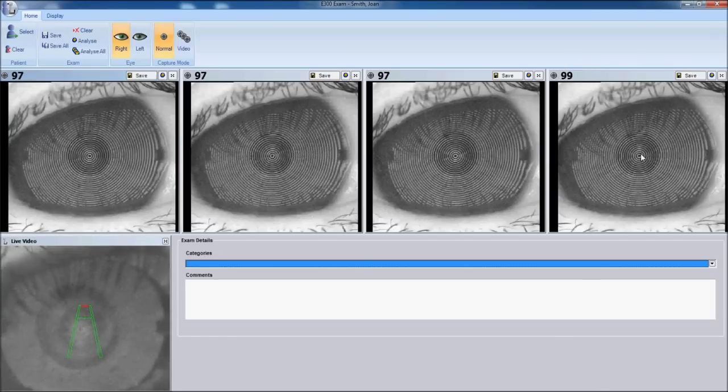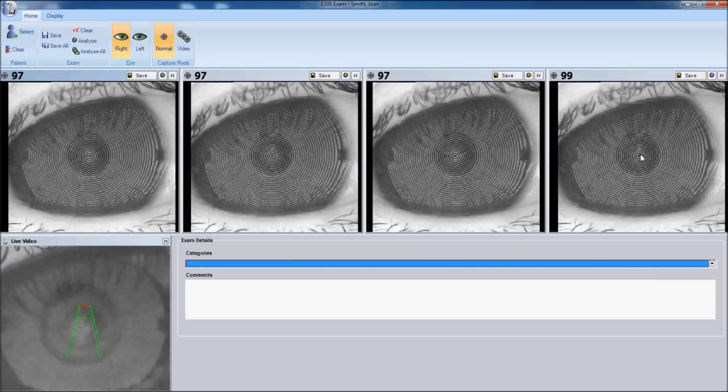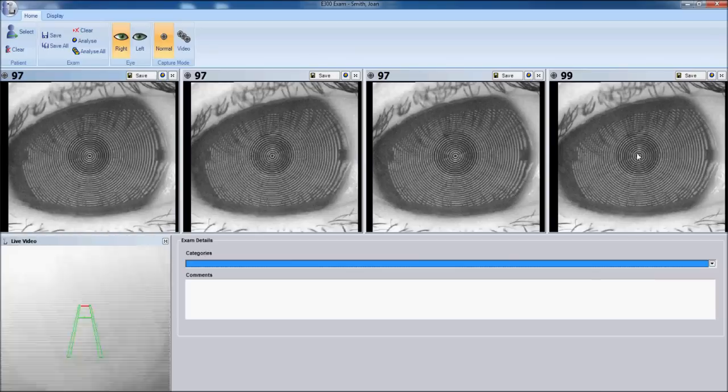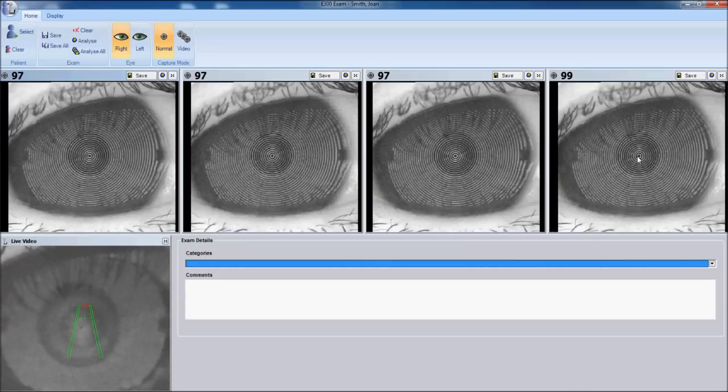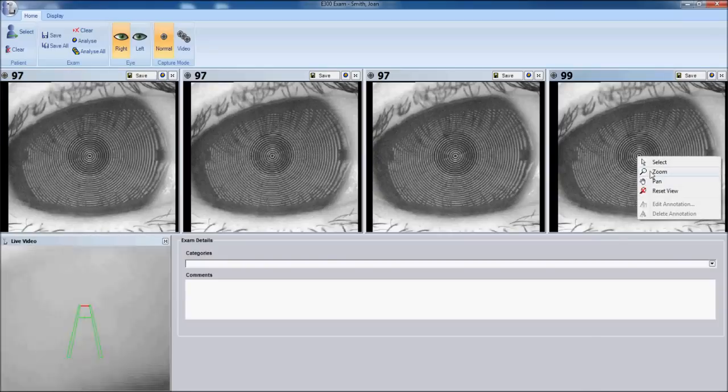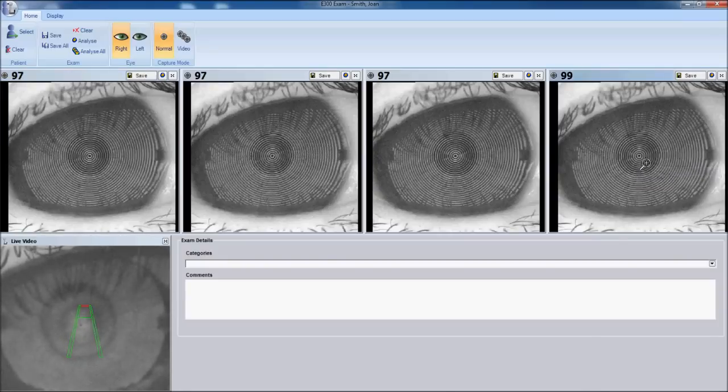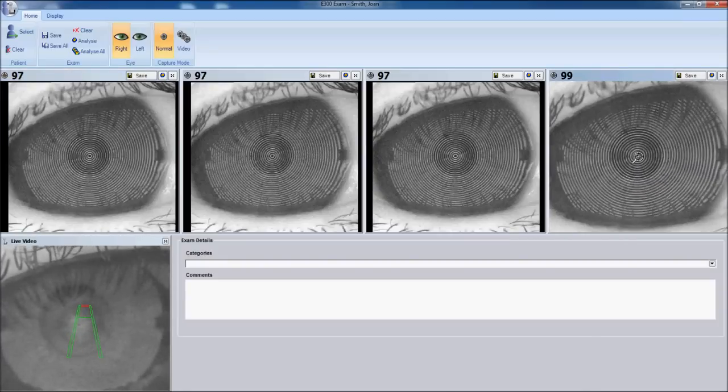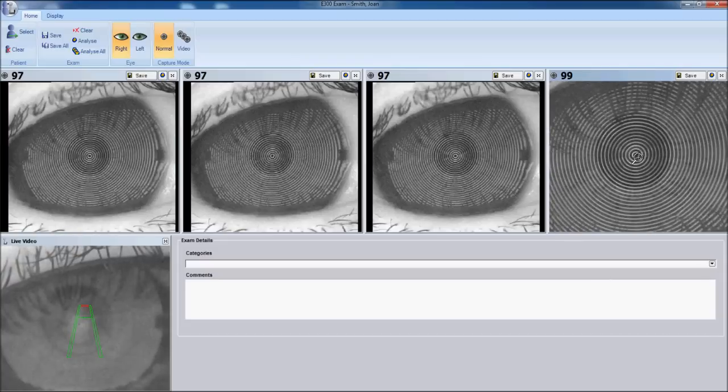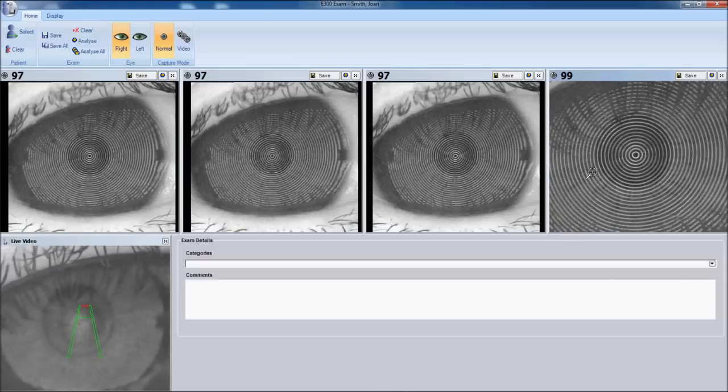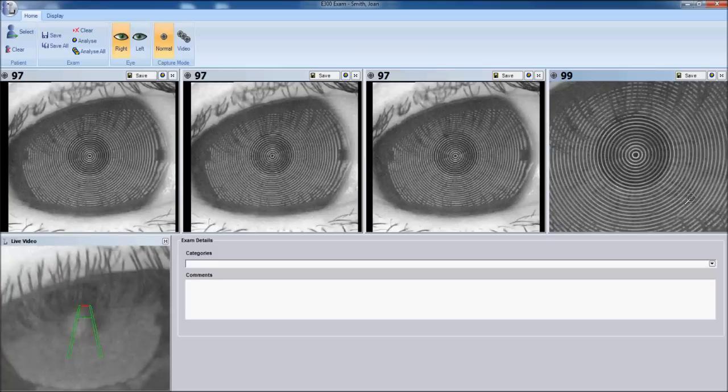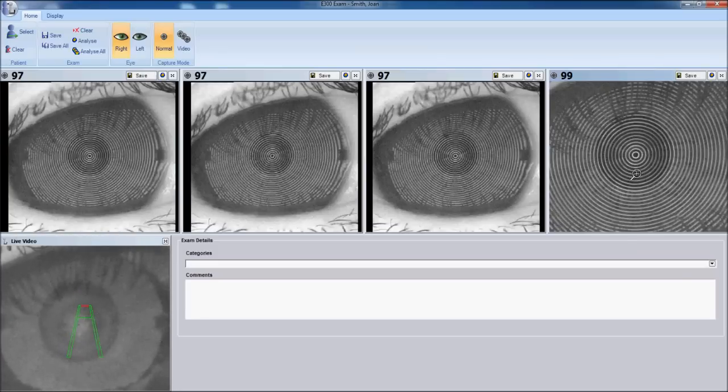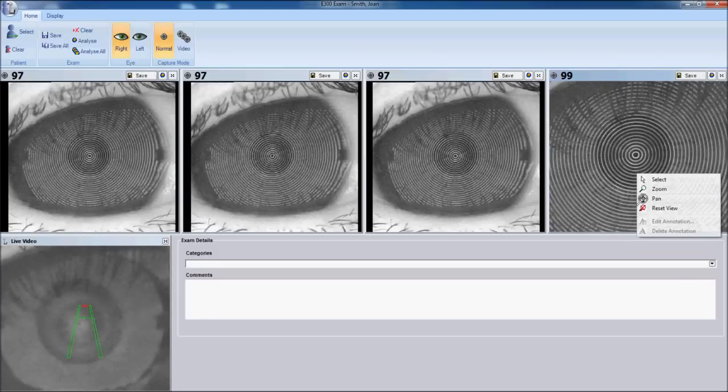However you must determine if the placido reflection is showing any tear film break up. Put your mouse on the right most image. Right click with your mouse and select the zoom tool. And zoom in on the central 10 to 15 rings. If they are reflecting parallel and even that would be devoid of any tear film break up. That is optimal for capture.